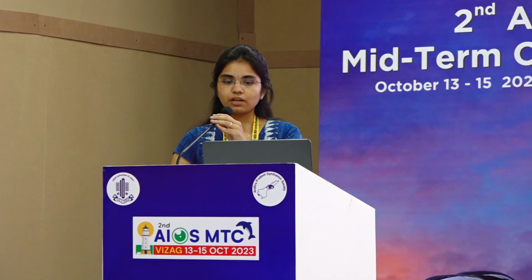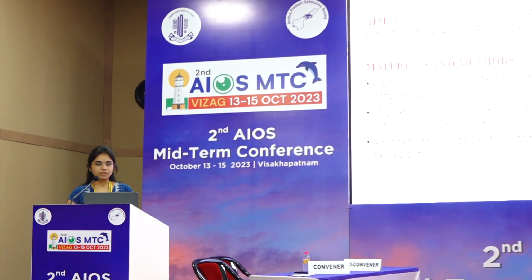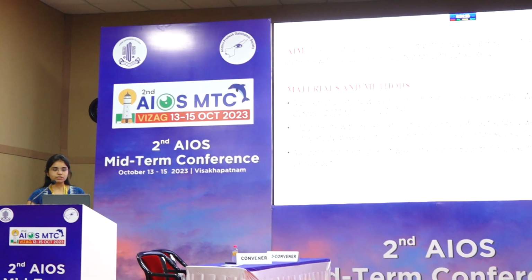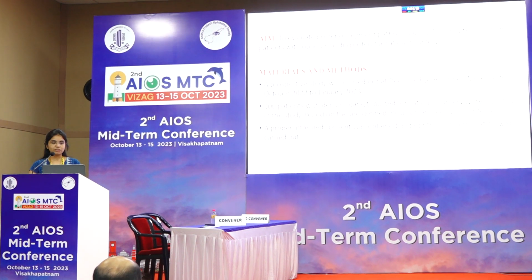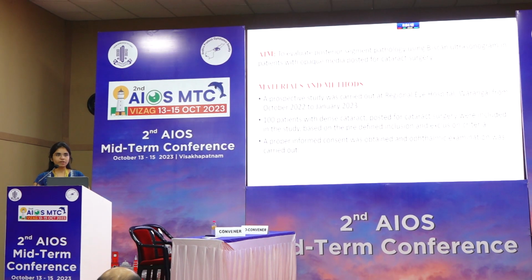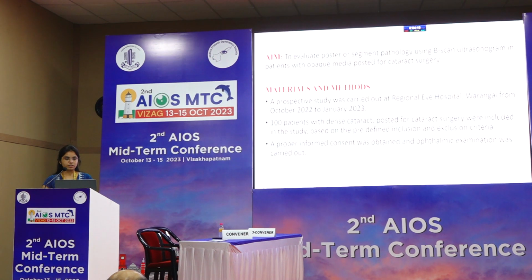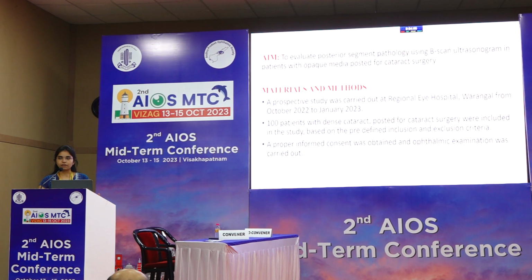Aim: to evaluate posterior segment pathology using B-scan ultrasonogram in patients with opaque media posted for cataract surgery. Materials and methods: a prospective study was carried out from October 2022 to January 2023. 100 patients with dense cataract posted for cataract surgery were included in the study based on the predefined inclusion and exclusion criteria. Proper informed consent was obtained and ophthalmic examination was carried out.